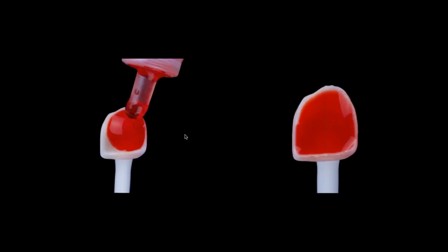So this is a lithium disilicate ceramic, VITA Ambria, so we need to apply hydrofluoric acid etching, okay? Here, as different than the feldspathic ceramic group, we have less glassy matrix and more crystalline phase. That's why this material is stronger. So we also need less time of hydrofluoric acid etching. So 20 seconds is sufficient time to etch the intaglio surface of the VITA Ambria restorations, okay?